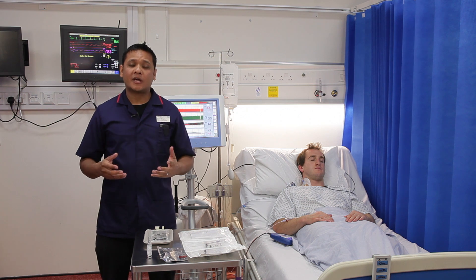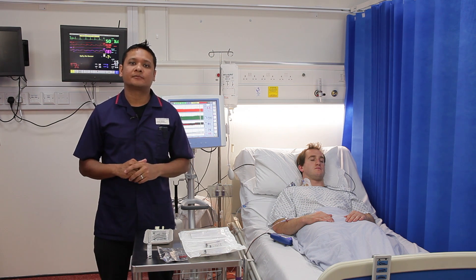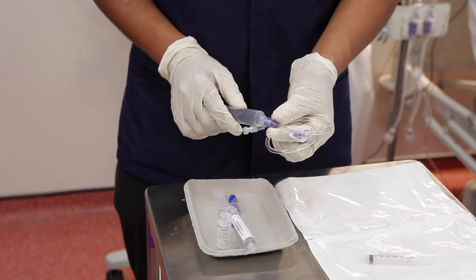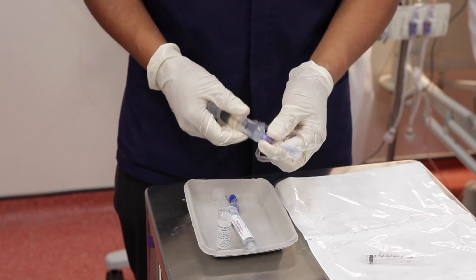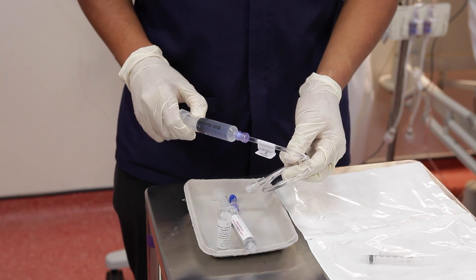In this section, I'll show you how to set up the venous side ready for calibration. Prime the Park and Ride tube with 0.9% sodium chloride and connect to either the CVP line or peripheral line.